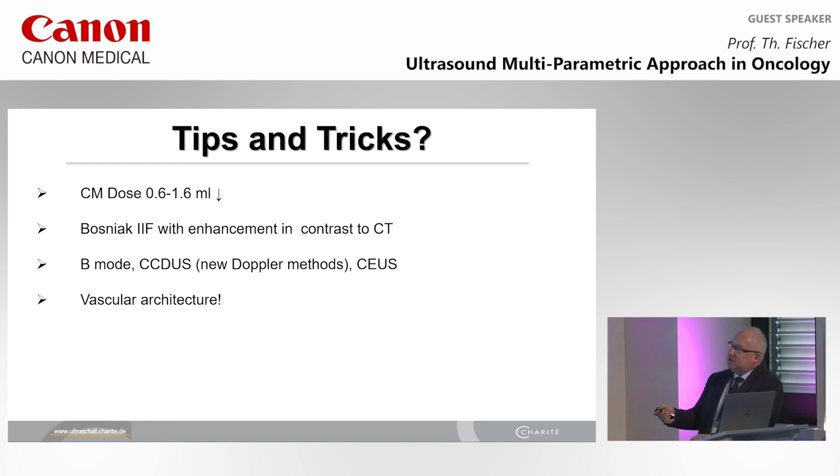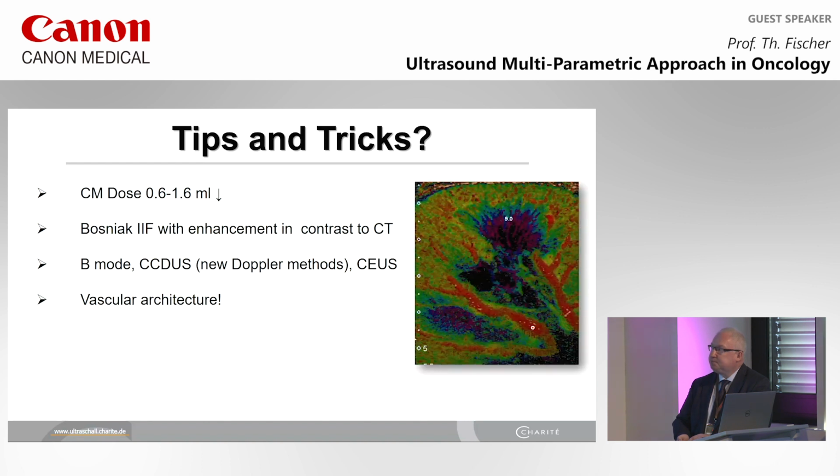2F classification is different between CT and contrast application in terms of the visibility of the vascular enhancement pattern. And I think especially the new Doppler technology, SMI, is very, very helpful to get in touch with the real architecture of these lesions. And so once again, the last point, vascular architecture plays a role and makes your decision or differential diagnosis, in my opinion.